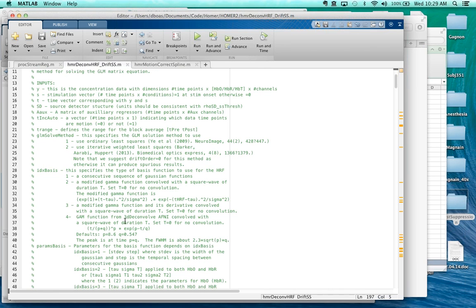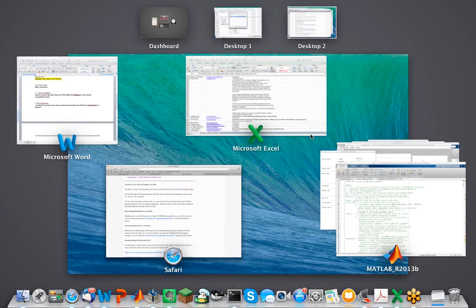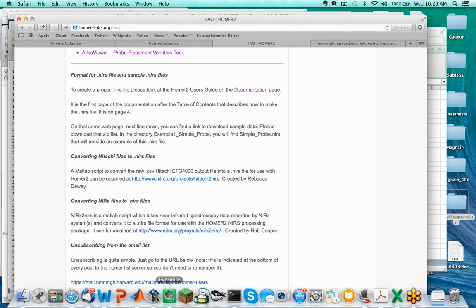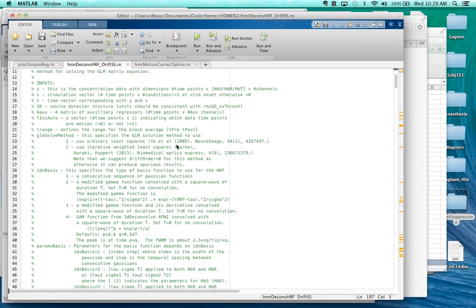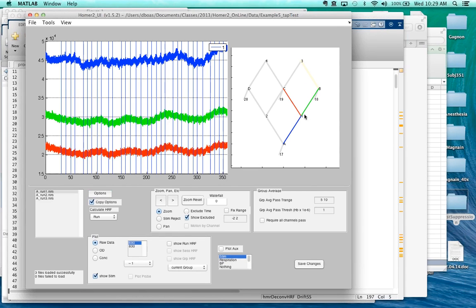We were just asked to add the AFNI basis function, so we added that. If there's any other basis functions you'd like to see added, you can just email me and we can discuss adding that basis function. I suspect that many people are interested in this question, so I could spend some time going through examples of different GLMs if people would like that.